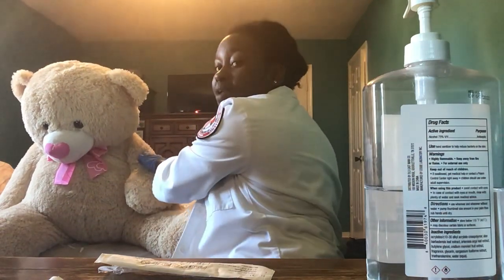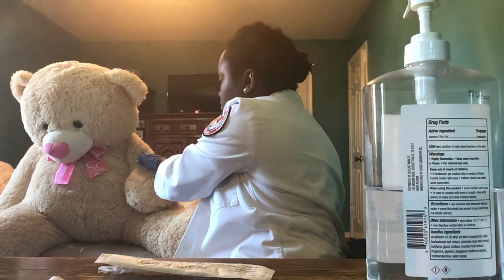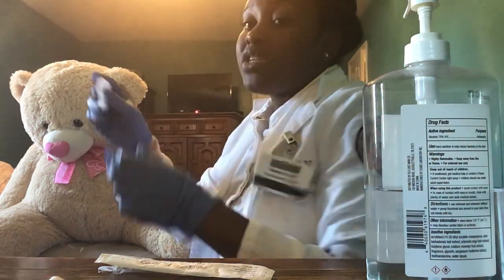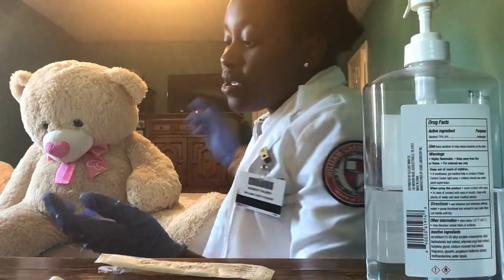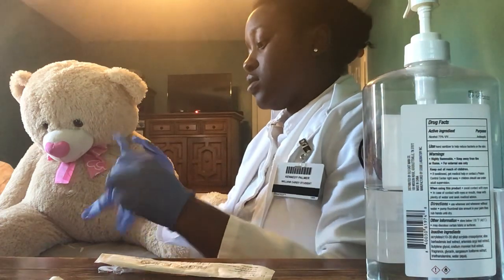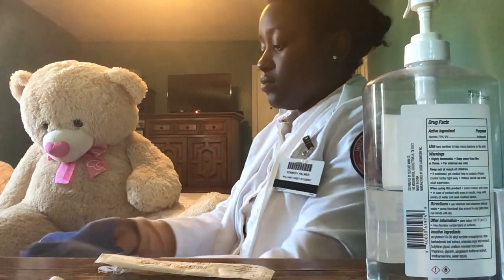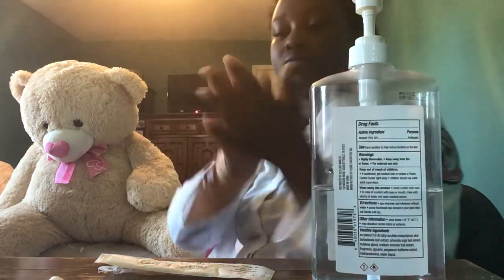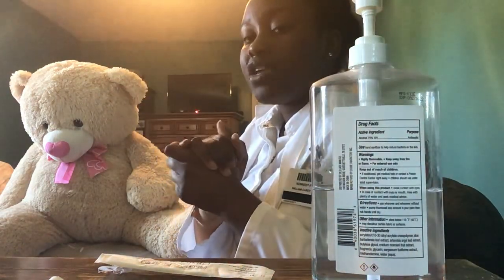I'm going to gently apply pressure with this cotton swab. Okay. After pressure has been applied, I'm going to dispose of this as well in the biohazard bin. I am going to remove my gloves and perform hand hygiene. And I'm going to document this procedure.